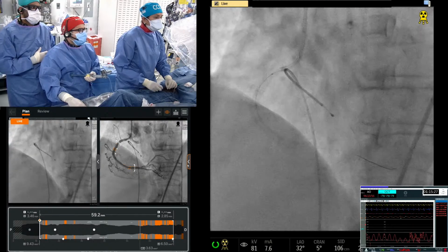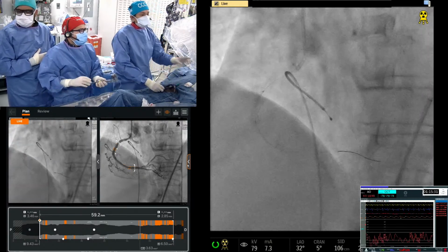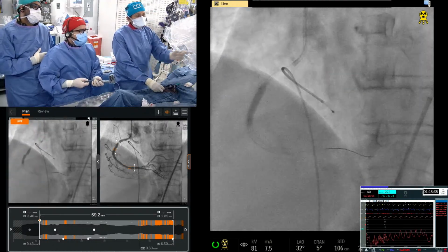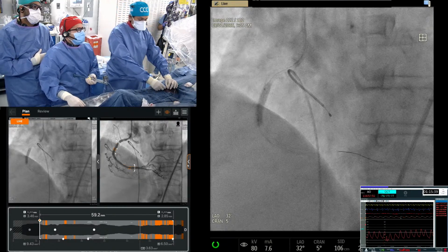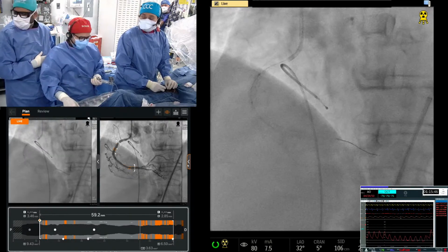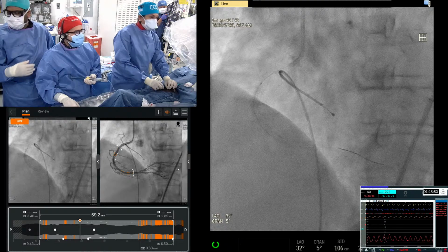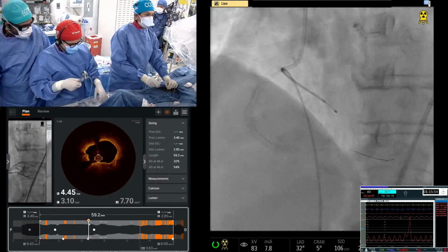I think 4.0 is good. Okay, good. Go up here. So you see that it's the same stent balloon, would not go in. So then we pulled back into the guide, you wrapped it, and then we go forward. You want a 4.5? No, 4.0. It's an elderly patient, heavily calcified vessel. Let's just be gentle. I think the MSA will be sufficient.